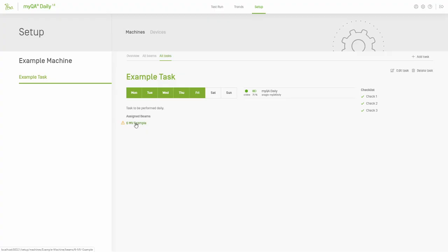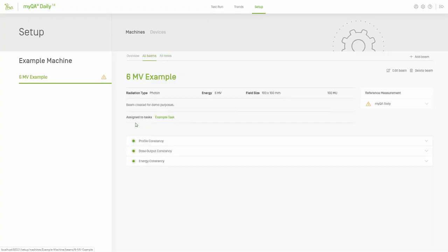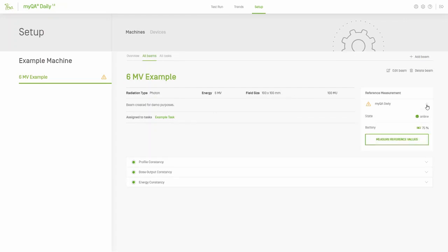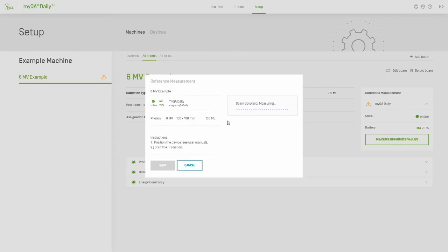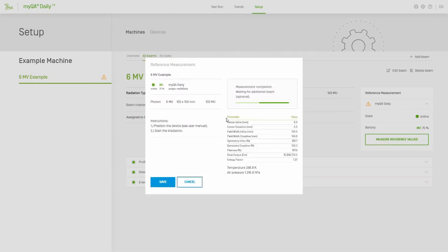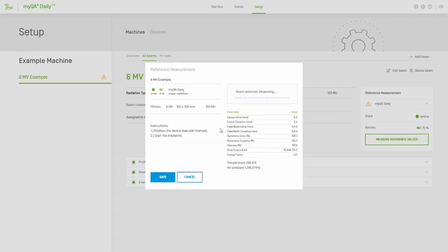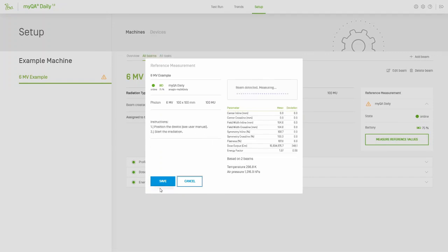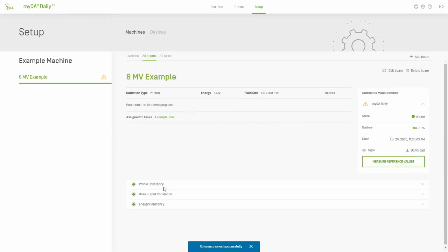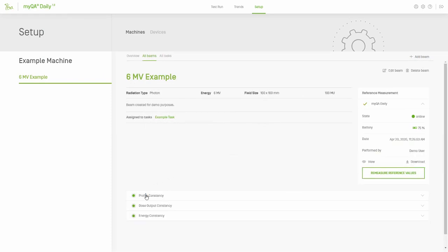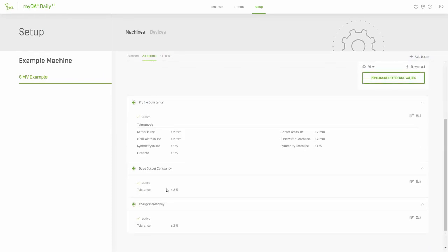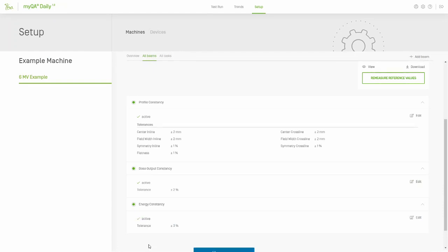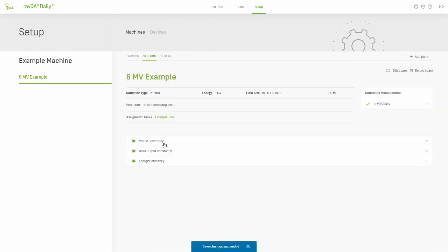The last step before the task is ready for use is to acquire a baseline measurement for that beam. The baseline measurement is beam-triggered, and the irradiation can be repeated a few times if desired. MyQA Daily will record the irradiations and define the baseline as the mean of the measurements, as well as provide the standard deviation for each of the properties. Once satisfied with the baselining data, it's also possible to view and edit the tolerances associated with each of the parameters measured.